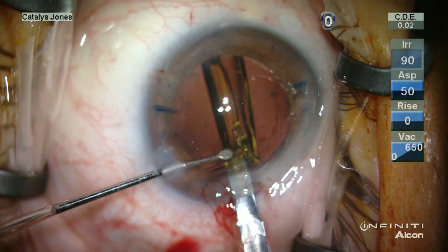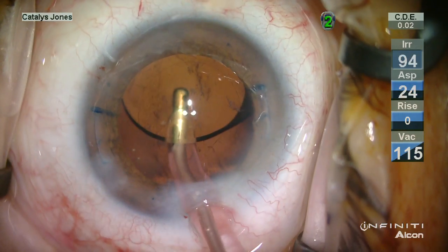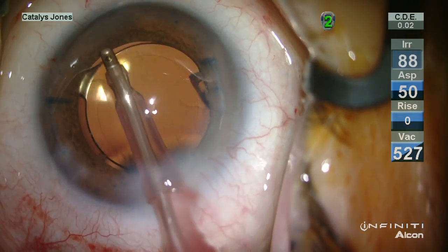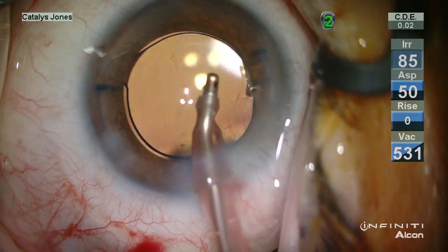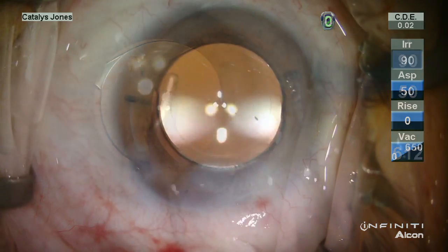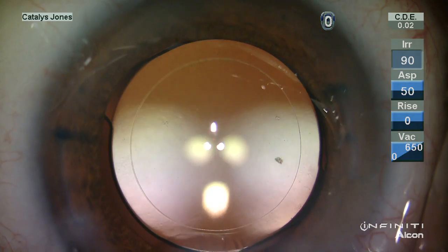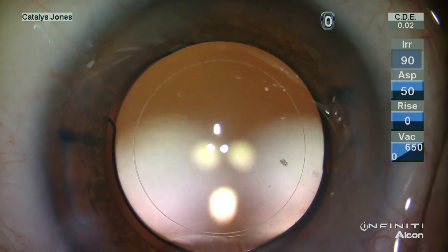This is a nine-and-a-half diopter IOL going into the capsular bag. This patient is fairly myopic, and I'd like to remove viscoelastic both posterior to and in front of the lens. This is Viscoat that's been on the endothelium throughout the case. Here you can see that the lens is perfectly centered within a beautiful capsulotomy.